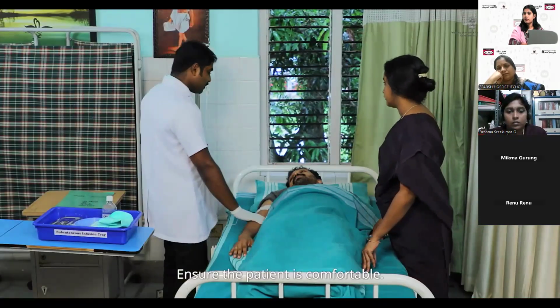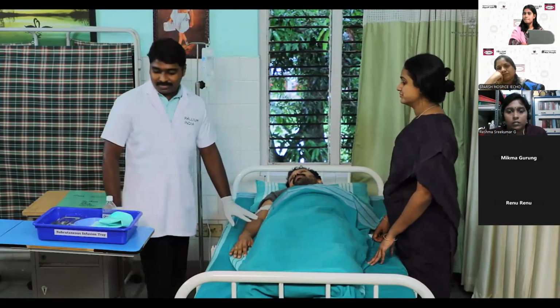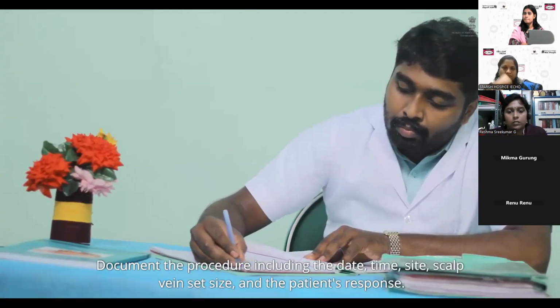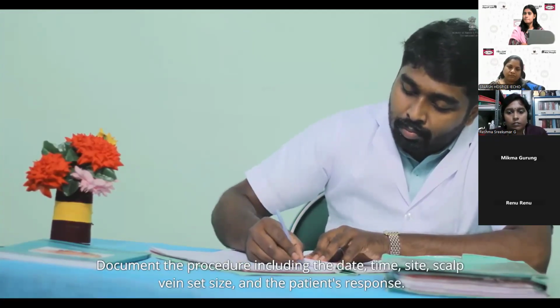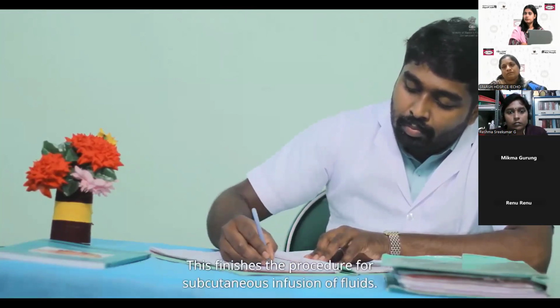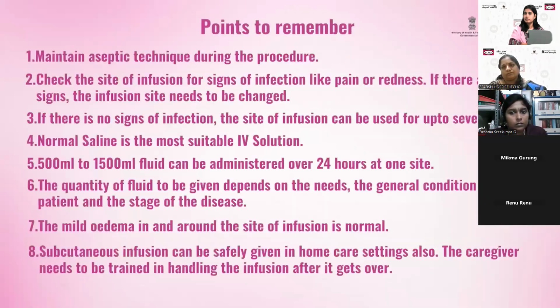Ensure patient is comfortable. Document the procedure including the date, time, site, scalp vein set size and the patient's response. This finishes the procedure for subcutaneous infusion of fluids. Points to remember: maintain aseptic technique during the procedure.